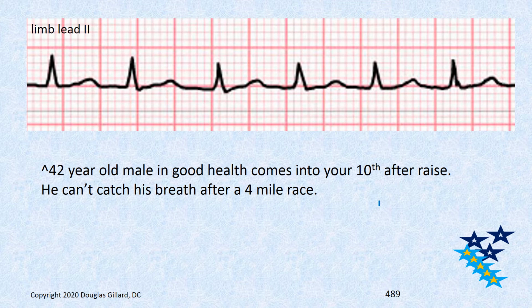Let's do another one. 42-year-old man. And by the way, you can bet there'll be a lot of these rhythm strips up on your final exam, so you better get used to looking at these things. I think I had about 10 of them last time, or 5 to 10 of them. There's a bunch of them, so make sure you know this, or you won't pass the test.